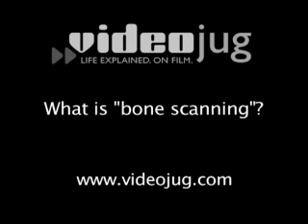Bone scanning. What is bone scanning? Bone scanning is a nuclear medicine procedure which basically looks at the turnover or reaction in the bones from a variety of reasons. We can use bone scanning to diagnose metastatic dissemination of cancer in the bone, or use it for looking at infection of the bone, fractures. Any disease process that involves the bone, bone scan is useful for.